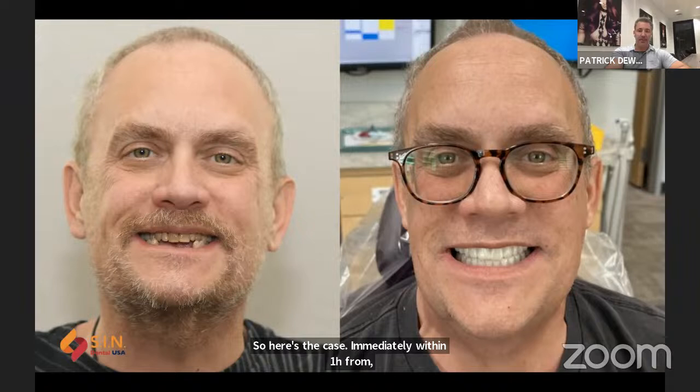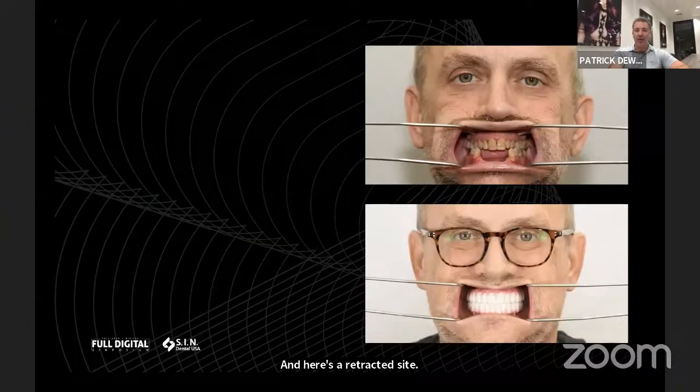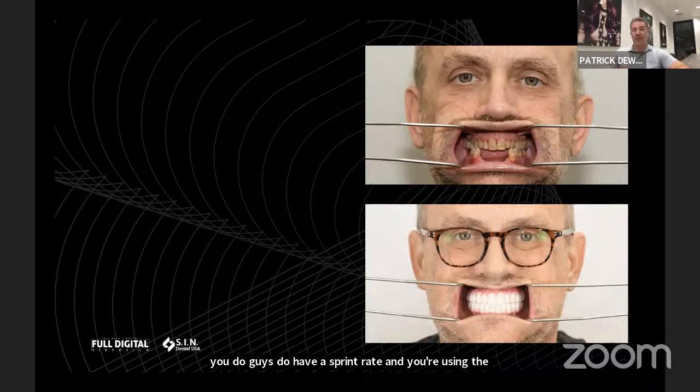So here's the case. Immediately within 1 hour from this one was probably a little bit extra because of sedation, but generally now we're delivering teeth within 1 hour. And here's a retracted site. It does come out, if you guys do have a Sprint Ray and you're using the Hollywood bleach, it's a very white restoration. So if it's a single arch you're doing and you need a matched natural dentition, you really have to tone down the white. I mean, let's be honest, it's a toilet bowl white. It's very bright. So they do have in the next 2 months, they're releasing 3 more shades, B shade and A shade, and I think a C shade as well. So we're really looking forward to those shades.